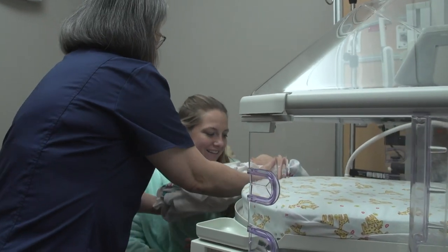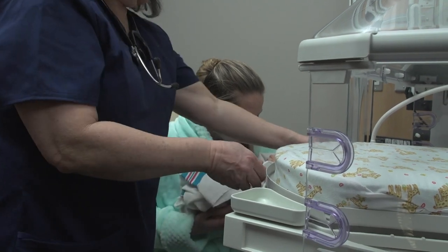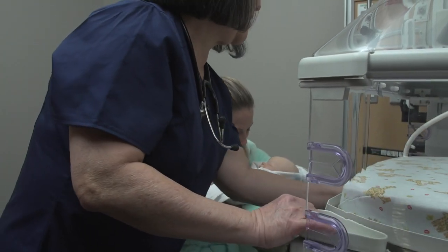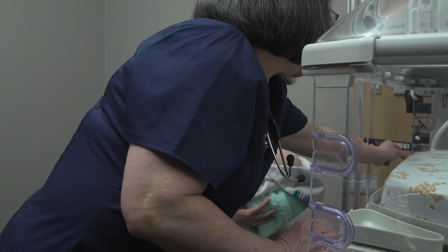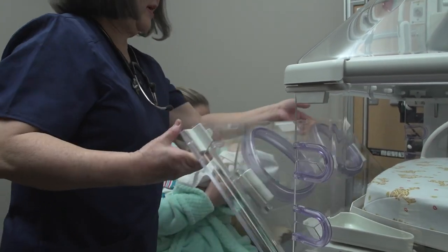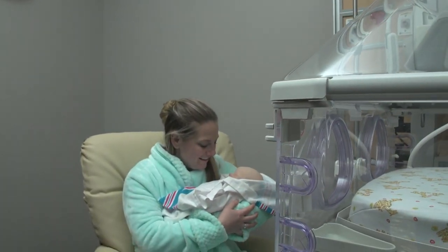This prompts the system to notify you when the patient's temperature changes beyond your chosen limit. In manual mode while the parent is holding their baby, temperature control is important and should be monitored and maintained closely. Adjust baby mode temperature as necessary to get the correct temperature at the remote measurement site, such as axilla or rectum.